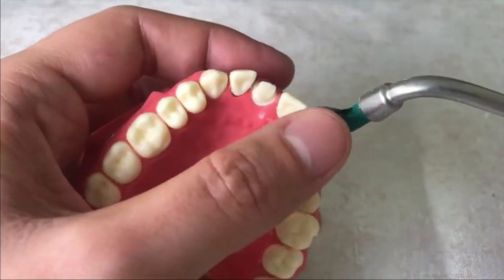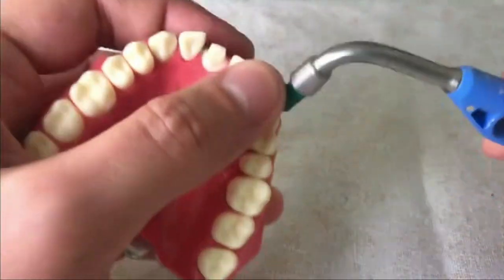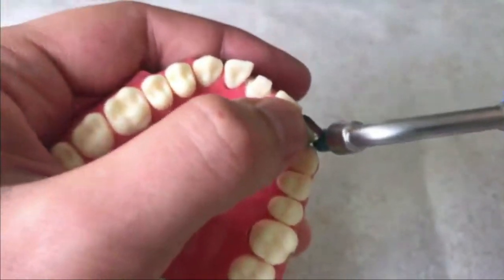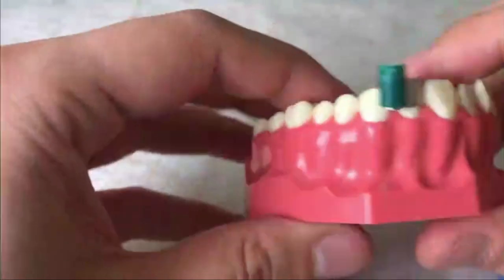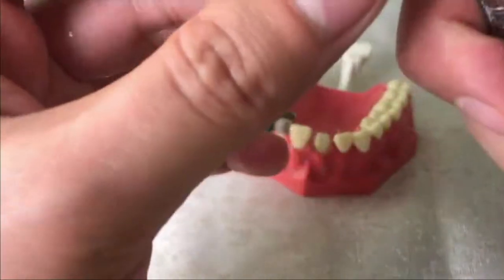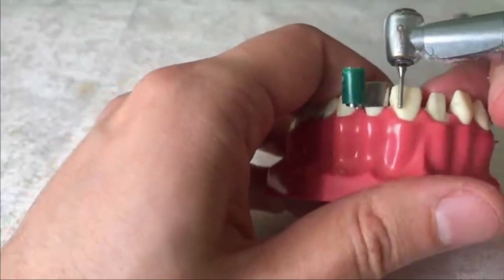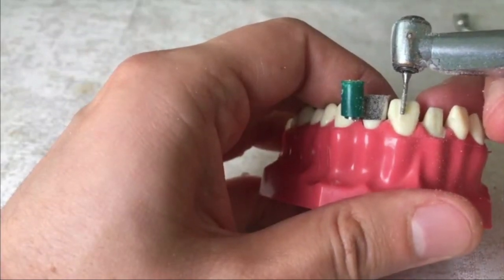First of all, I place my matrix band on the adjacent teeth. Then I insert my 2mm diameter shoulder burr. We control the preparation depth with guiding grooves. If you want to prepare at 2mm depth, you insert a cylinder burr at 2mm thickness and prepare guiding grooves.